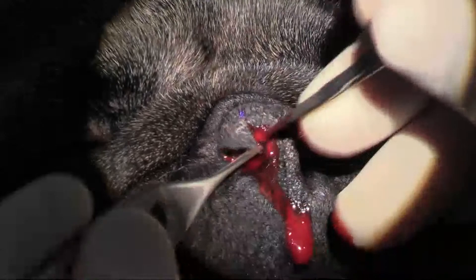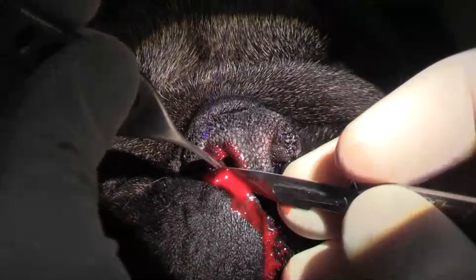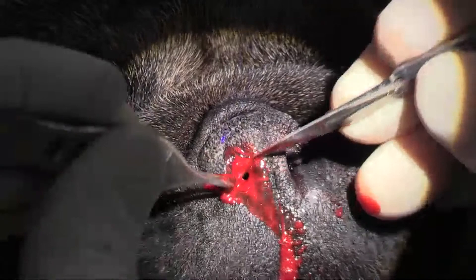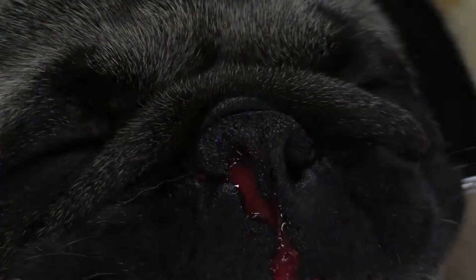This side is bleeding a little bit more than the other side. Just lift up on the stay suture — even the action of just lifting up on the stay suture is going to help stem the flow of blood.